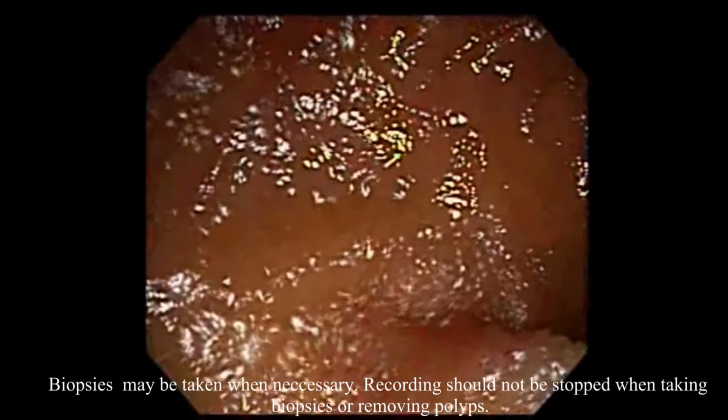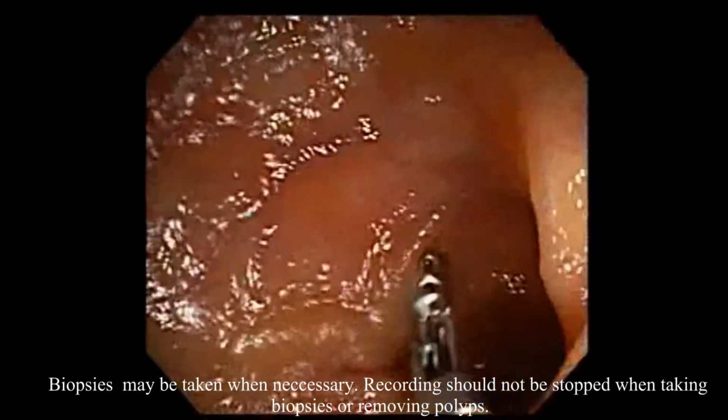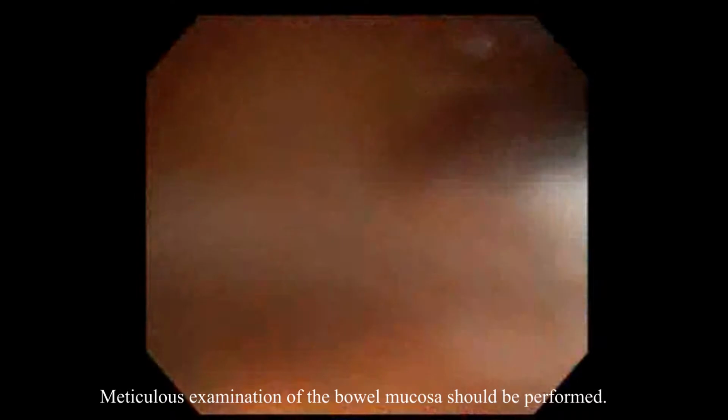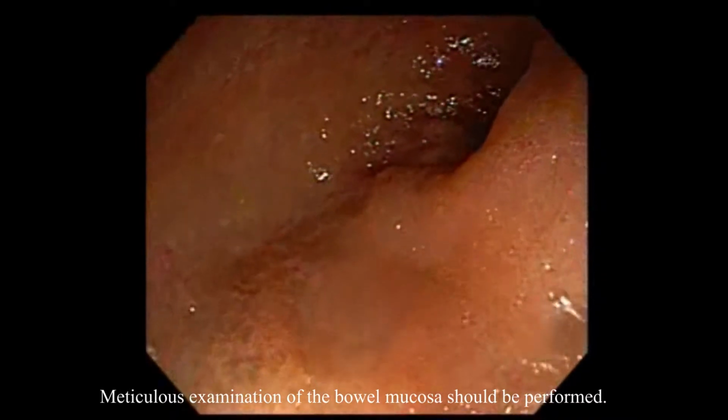Biopsies may be taken when necessary. Recording should not be stopped when taking biopsies or removing polyps. Meticulous examination of the bowel mucosa should be performed.